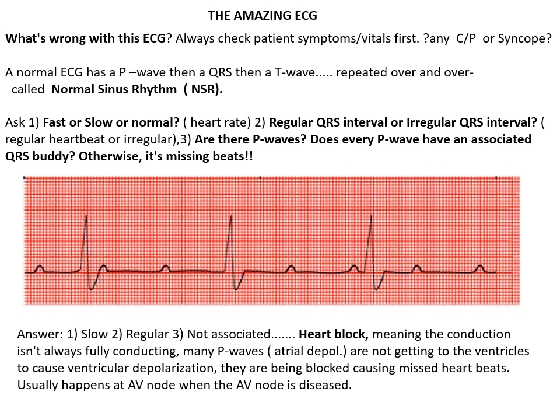Okay, so if you were to take a ruler and measure these P waves, they would be perfectly lined up. So there's a P wave right to the left of the rhythm strip, on the left-hand side. There's actually a P wave that's just at the end of the first QRS, and then just measure them, and you'll see that they measure up just perfectly. So this is telling us that the atria, or the SA node, which is where the automated beats are coming from in your heart, are delivering beats to the atria, causing atrial depolarization.